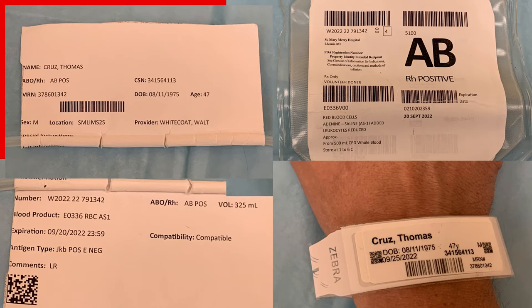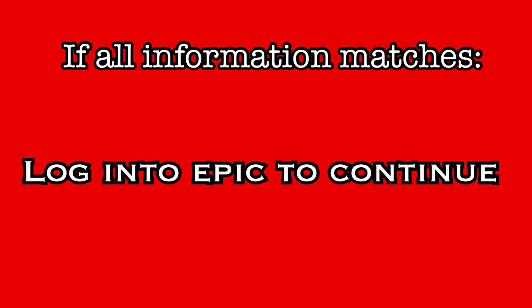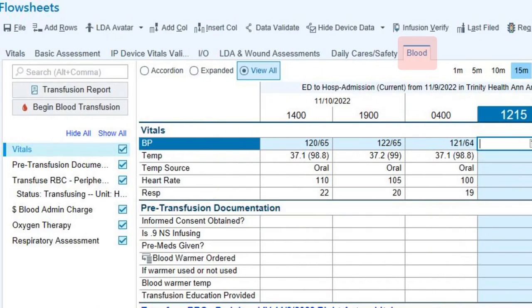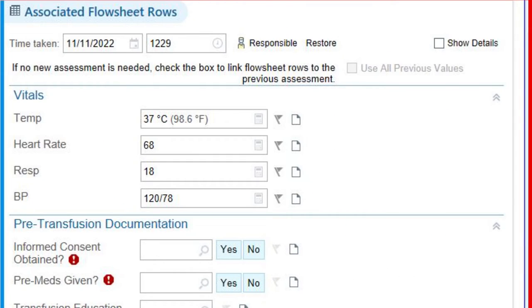If all information matches, the product is safe to administer. If there are any discrepancies, do not administer this product but instead contact blood bank immediately. If the verification was successful, log into EPIC to finish the process. Go to the blood flow sheet and click on Begin Blood Transfusion. A prompt appears to link the product to a specific IV — choose the line that will be used for this transfusion. Then scan the unit number, product code, blood type, and expiration date barcodes. If pre-vitals were charted within the last 30 minutes, they should auto-populate in the vitals field; if they do not populate, enter them here.